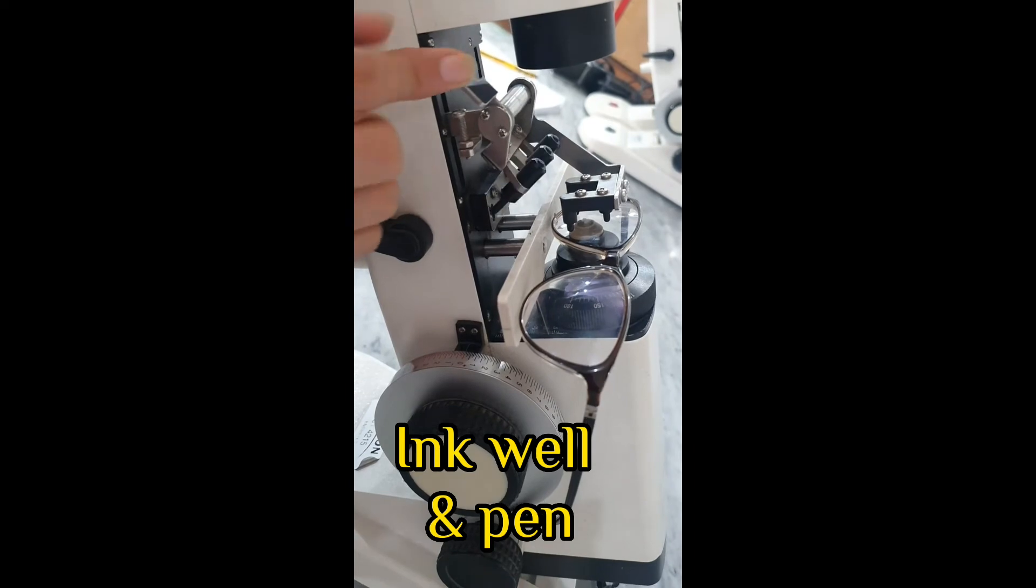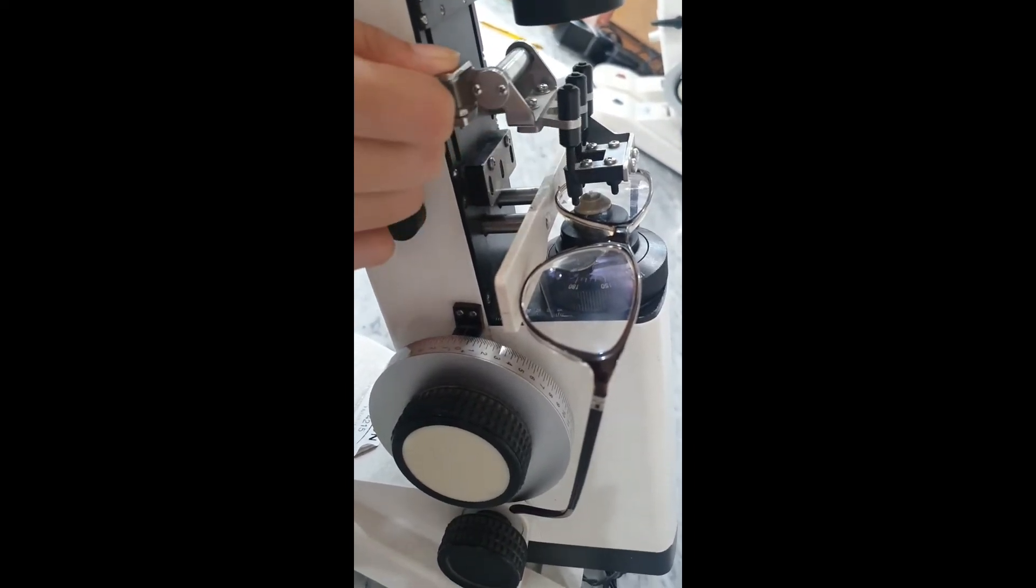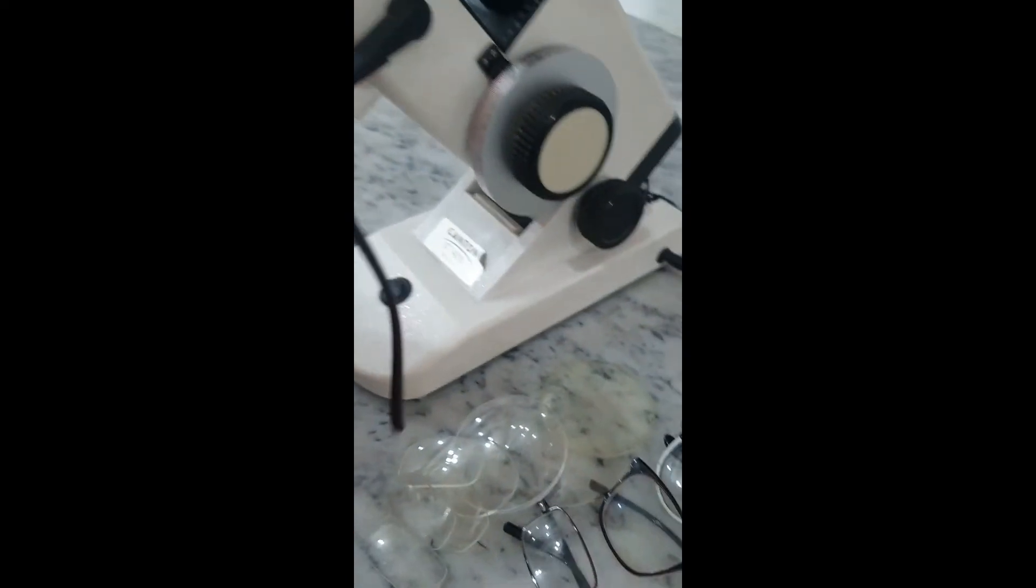Inkwell and pen for dotting the optical center of the lens. Optical center vary from patient to patient. So, different lenses have different OC. This is the marked OC of a sample lens.